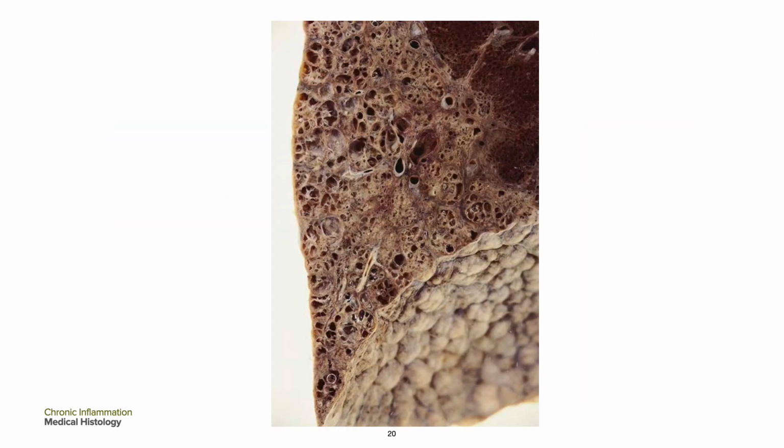This is a honeycomb lung, in which the patient had interstitial pulmonary fibrosis, the exact cause of which was not determined.